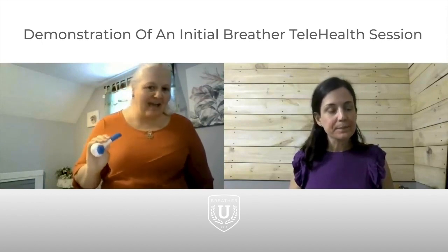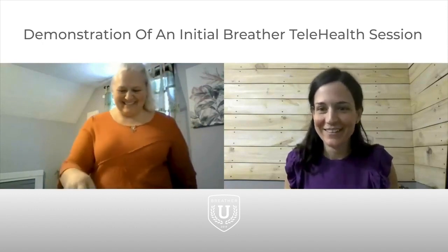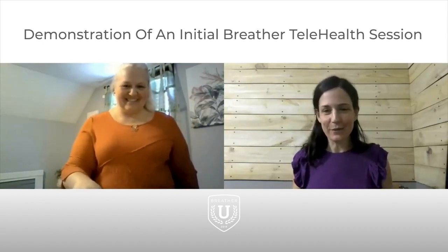And I'll try to count next time. Whenever you're doing your exercises, you'll do 10, and then I want a nice break in between, at least 2 minutes. This isn't the same thing as skeletal muscle training. You use your lungs to oxygenate, so let yourself come completely back to rest. So at least 2 minutes.